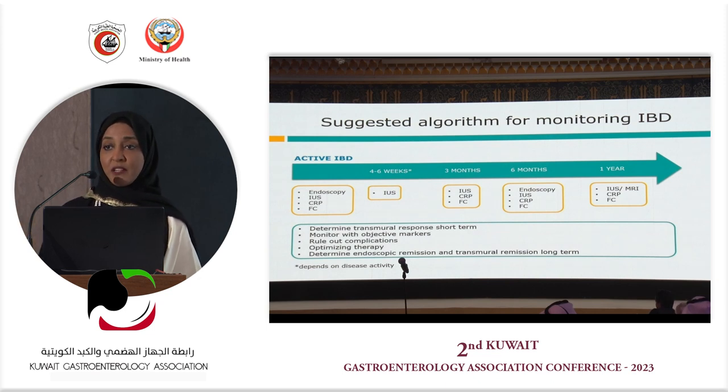At 6 months, again, we have to repeat the investigations from scratch, including the bowel ultrasound, and even after a year. So a 3-month interval is reasonable in following up our patients.